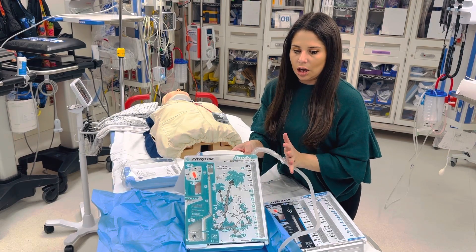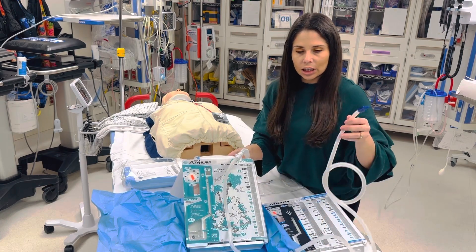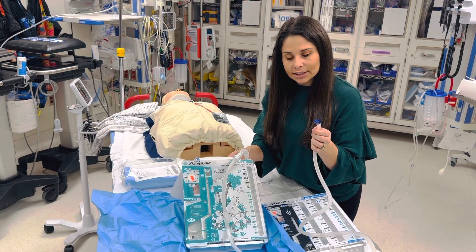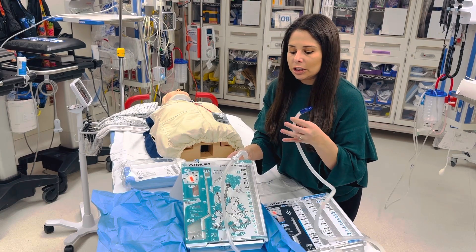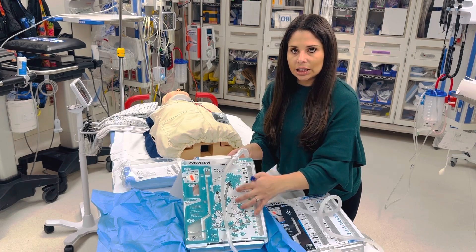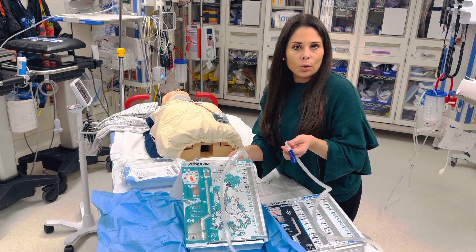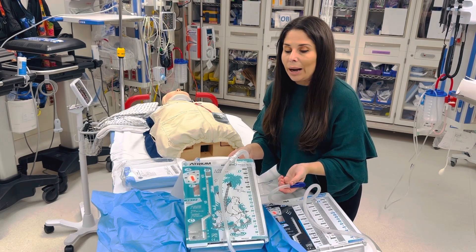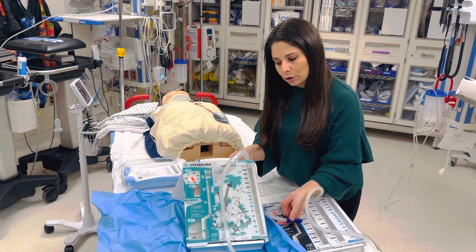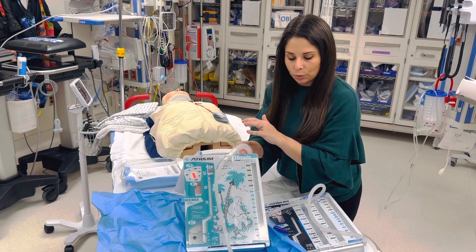This tube right here is pulling the air out of your chest, along with other things — blood, pus, fluid. It's pulling it out and taking it into the drainage chamber. When it pulls air out, air is going to want to rise back into the chest. The only thing that's trapping air in the chest tube is your water seal. That's how the water seal chest tube works.